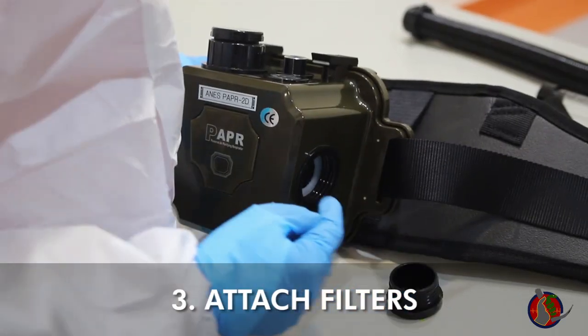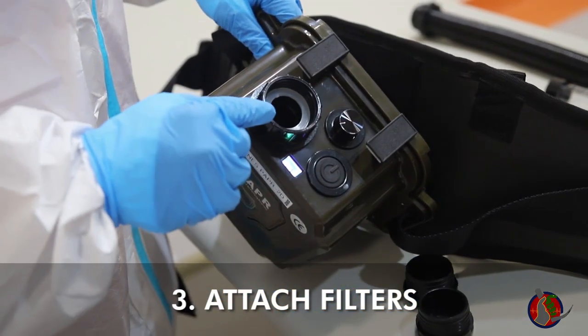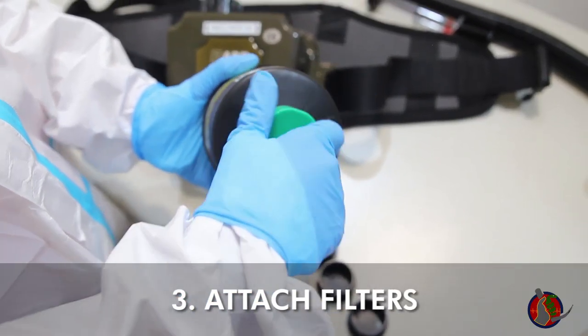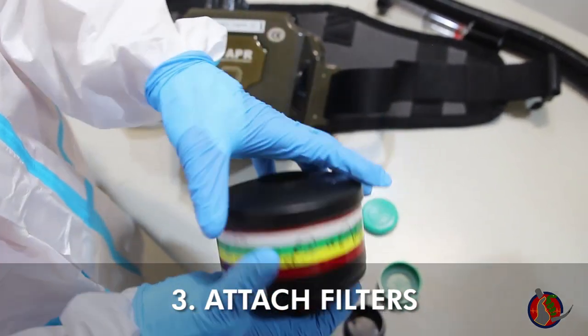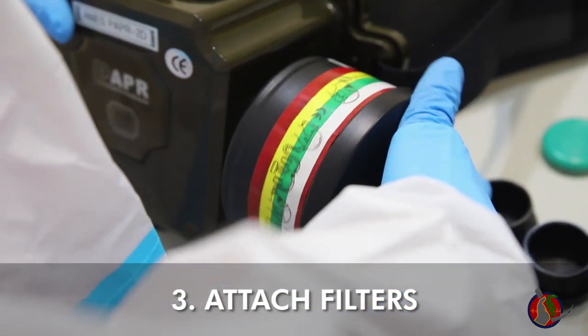Remove caps from two air inlets and one air outlet, checking that the white silicone gasket is intact in all ports. Then uncap the filter inlet and outlet.